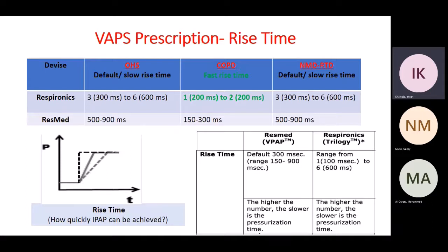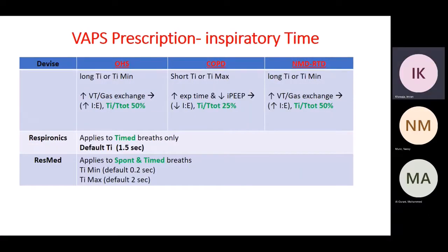Even in the acute setting in the hospital, yeah, it's better to do it. Correct. Yeah, I'm just emphasizing this is the same concept that applies there as well. And again, there is no way that from this lecture you will memorize all these, so you need to keep it handy, but this is the concept here. And then the inspiratory time. So inspiratory time is different across the disease states, as what you see here.